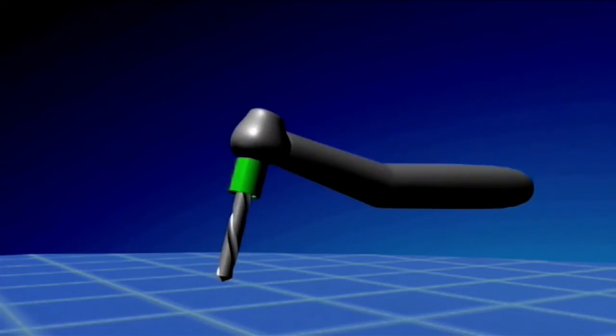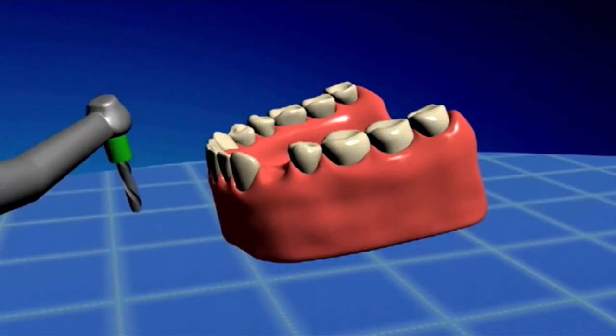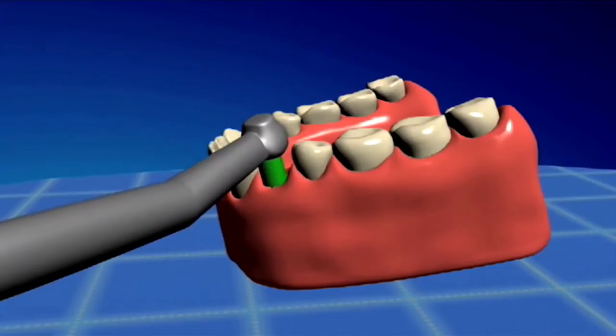A surprising benefit is the help the drill stop cylinder is in orienting the initial penetration. It is the approximate size of the future healing abutment and aids in visualizing the restorative position.